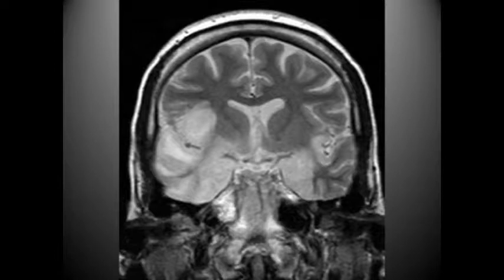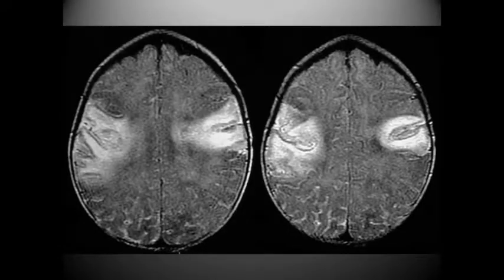Okay, on this image we have encephalitis. Notice these areas in the brain here. That's correlated very well with this image that we see.